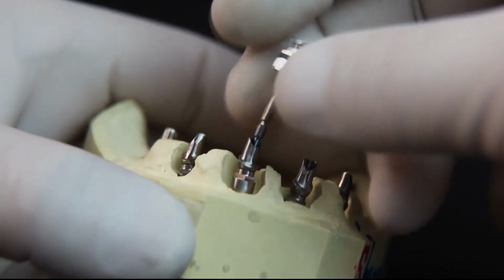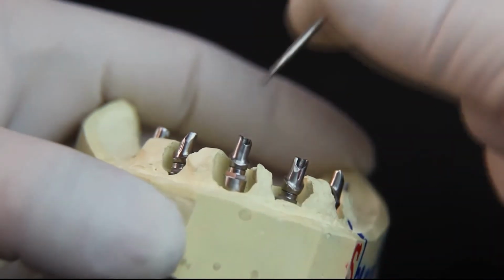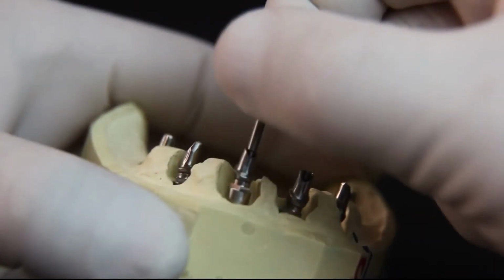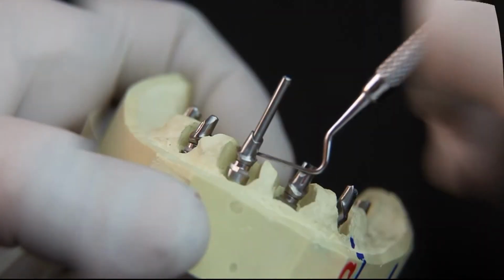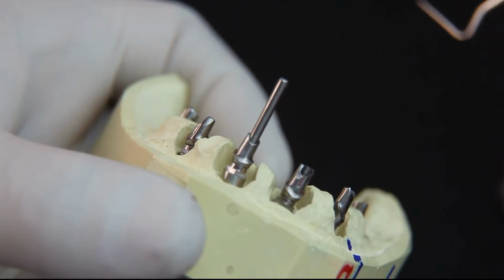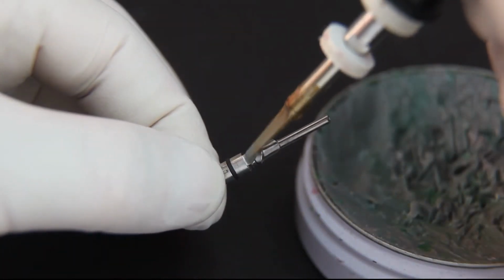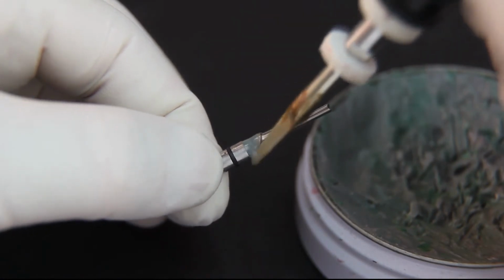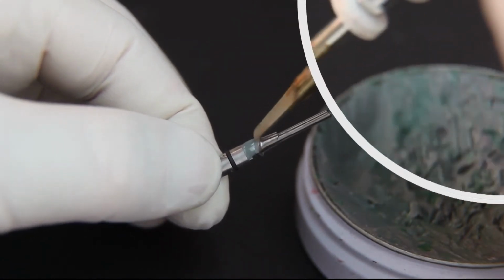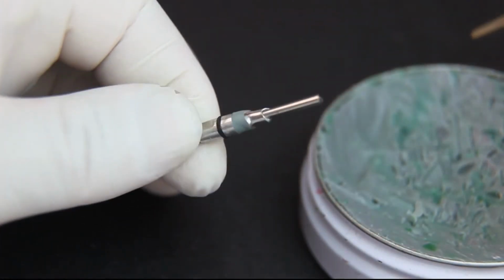First, a standard screw that attaches the abutment to the analog is substituted by a screw with an elongated body. The elongated body of the screw is essentially a funnel through which the material of the duplicate will be filled in. Then the space between the shoulder of the abutment and the edge of the outer round platform of the analog is filled with wax.